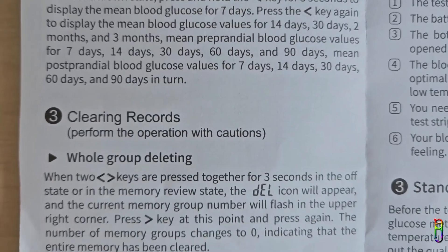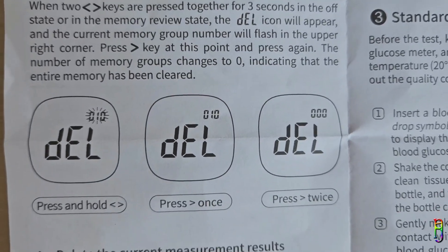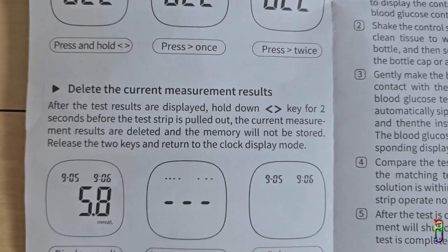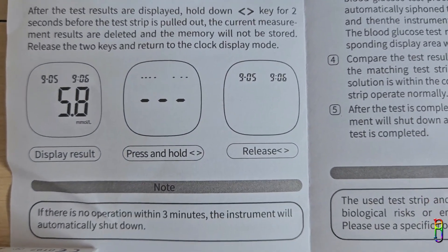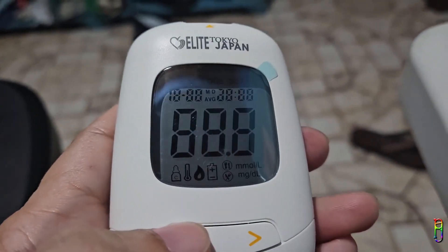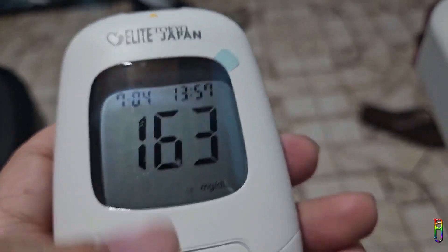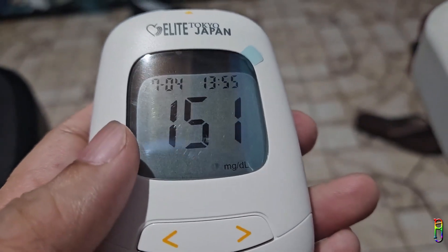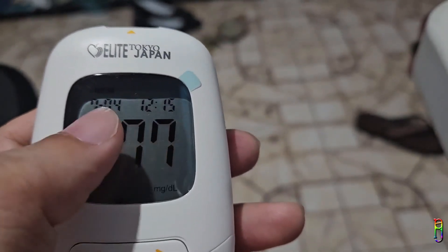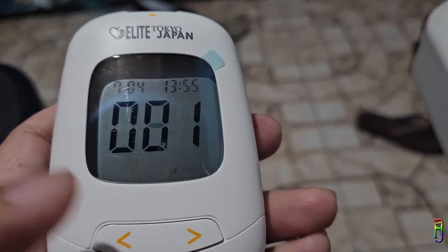The IGM 107 glucometer can hold up to 250 records in its memory. I'm now showing the part in the manual discussing how to view and operate these memories — you can pause the video to read through it. For a quick demo: while the glucometer is turned off, pressing the left button once will turn it on and display the latest blood test, which is record number one, showing the date and time above and the reading in large numbers. Pressing the right button goes to the next record.